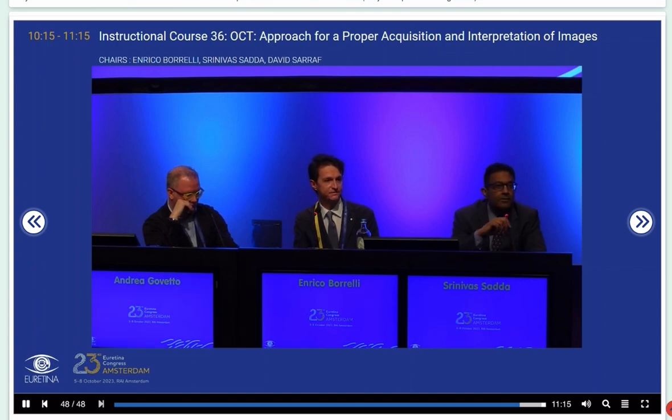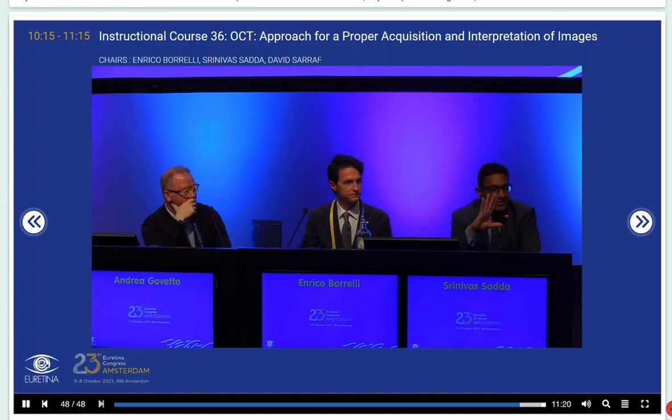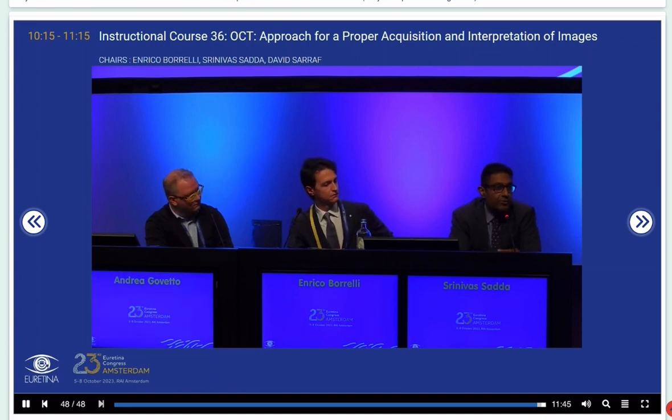Thank you. Can I make one comment? From being a semantic stickler, really it's not a cyst obviously, but we like the term cystoid space. But it's still used, but I guess people have recognized that intraretinal fluid can be in cystoid spaces, or there can be more diffuse thickening of the retina where you don't see discrete cystoid spaces. So sometimes people use the overarching term intraretinal fluid to be suggestive of both. But I don't think that it's fallen out of favor. Yeah.